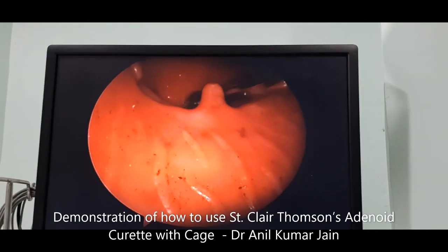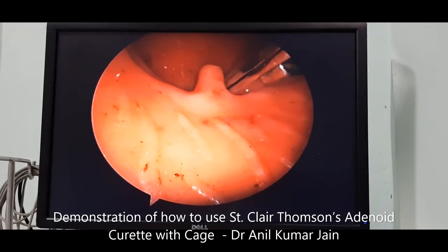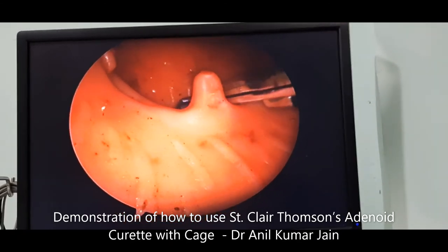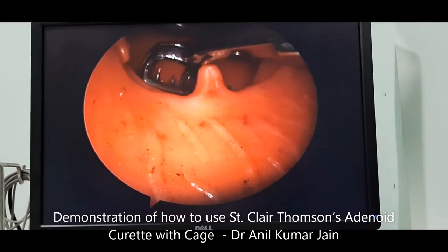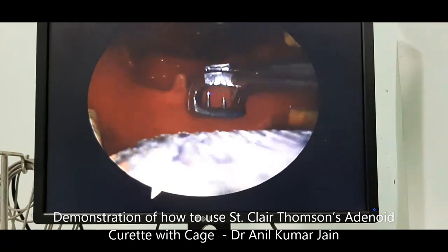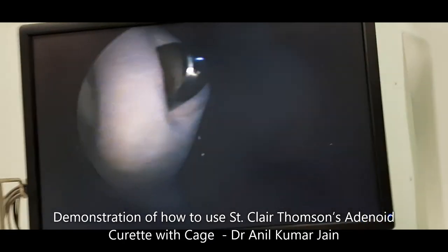Rotate again, stay in midline. Gently press against the posterior wall to remove the adenoids. Come out gently, then you can remove the adenoids from the nasopharyngeal area. Please see how I am holding it — it has to be held firmly like a dagger.